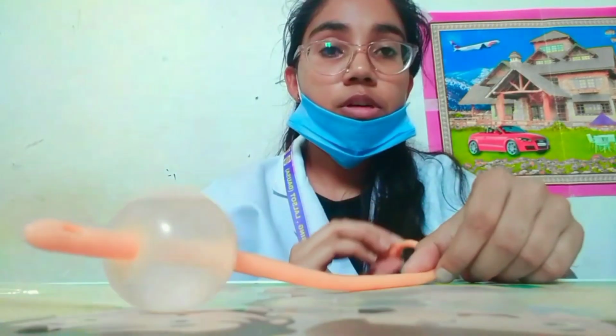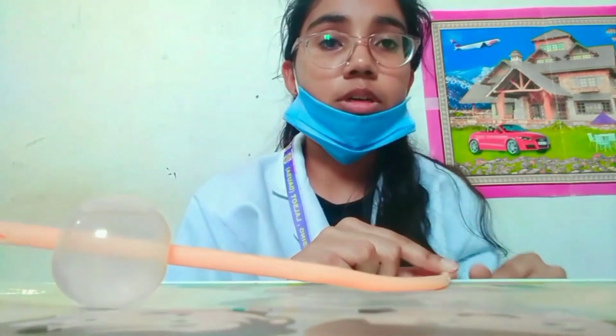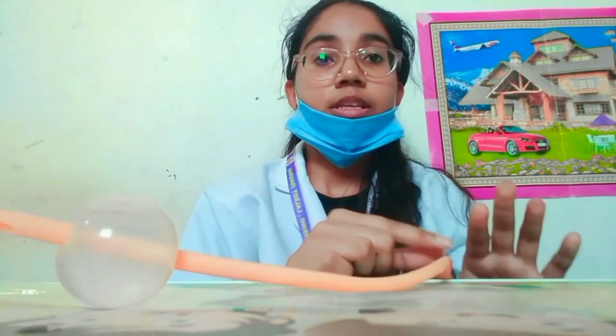And towards the gravity we will place it to help the flow of urine from the urinary bladder to the urinary drainage bag. Okay. Then after that, this is the performing phase in which we perform urinary catheterization in the patient. After that, the third phase is the post phase. In this phase, remove gloves and perform hand hygiene to prevent transmission of infection. After that, lastly, document the procedure time, date, characteristics of urine and monitor the output of urine. All these things are recorded in nursing charts.